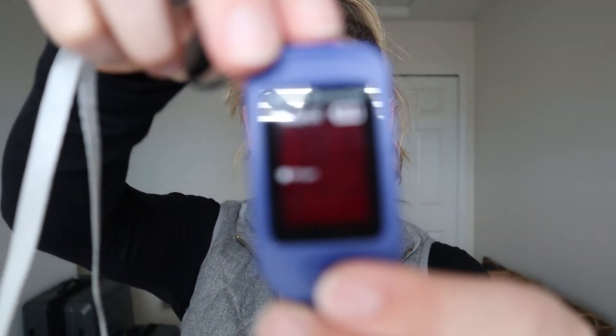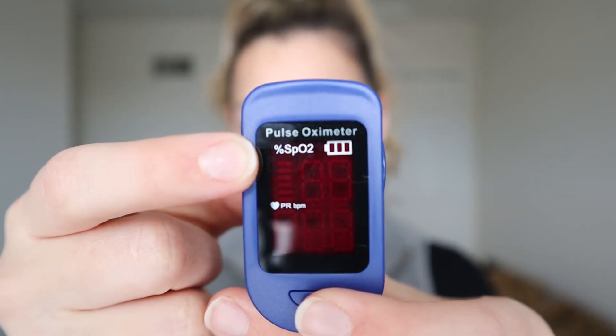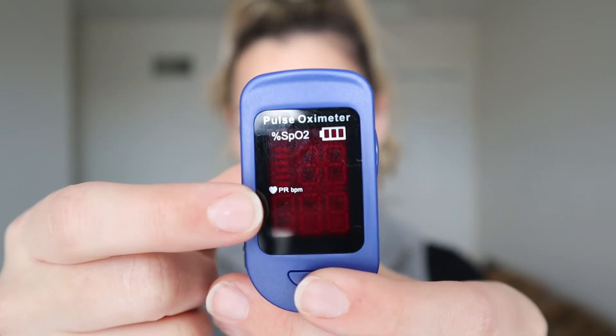This is the pulse ox that I have here. Typically pulse oxes also check your heart rate. So you can see here the top is SpO2 — that is your oxygen saturation — and the bottom would be the heart rate. Next, what is this little thing actually measuring? This is measuring how much oxygen is attached to your hemoglobin, so how much is flowing with the hemoglobin.